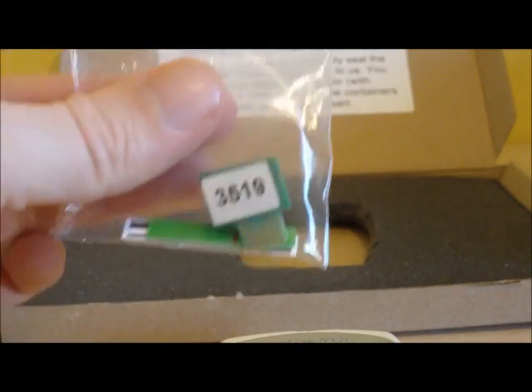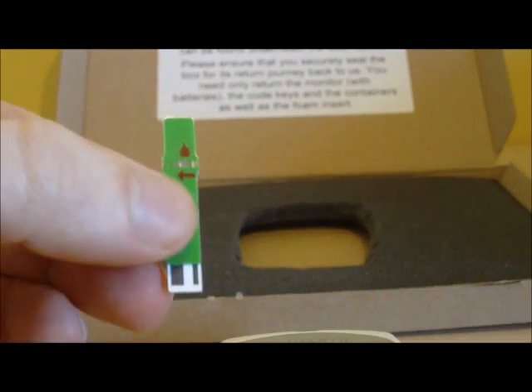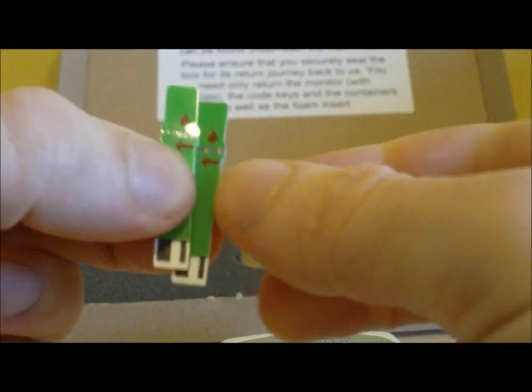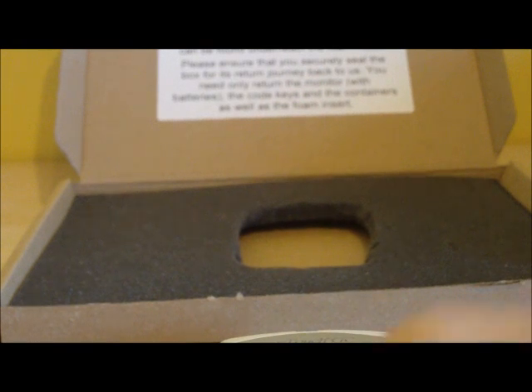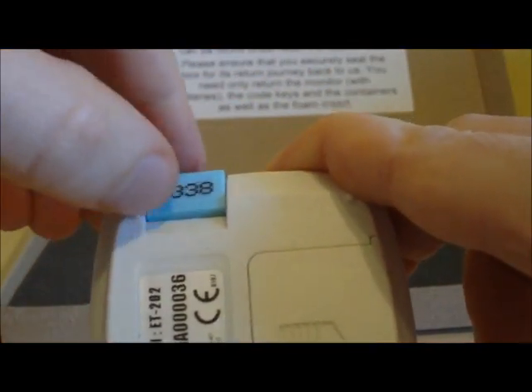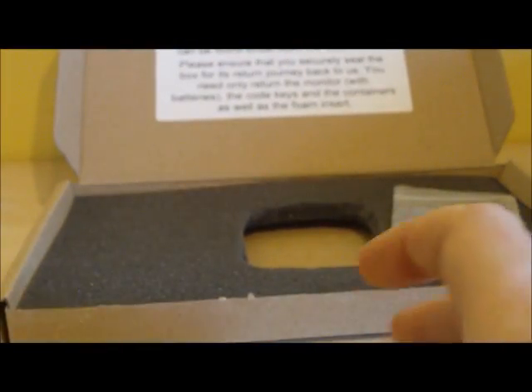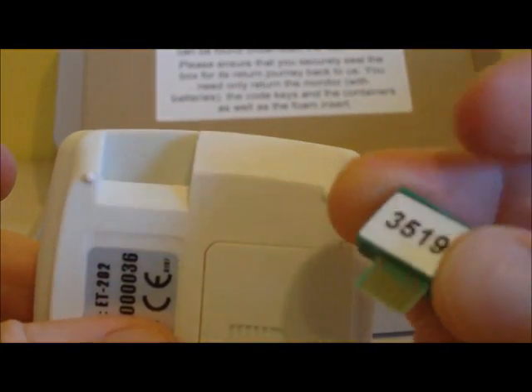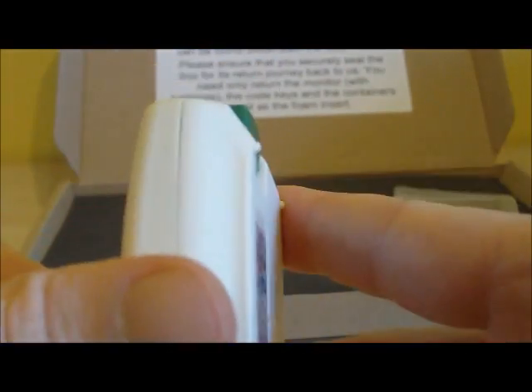Take your glucose test strip and code key and remove them from the bag provided. There are two glucose test strips — one for the fasting level and one in case you want to measure your non-fasting level. Remove the cholesterol code key from the monitor, which needs to go back in a bag and be returned in the box. Then insert the green glucose code key, which fits in only one way, just like the cholesterol key.